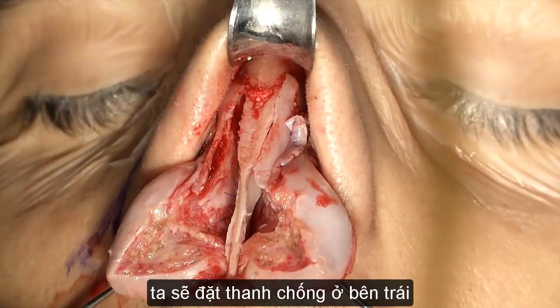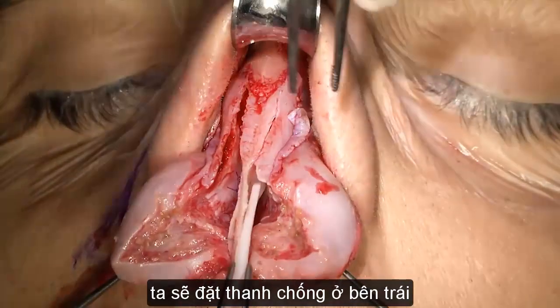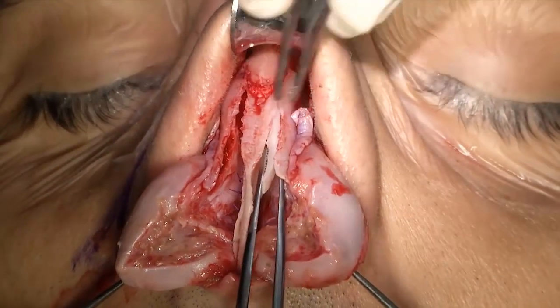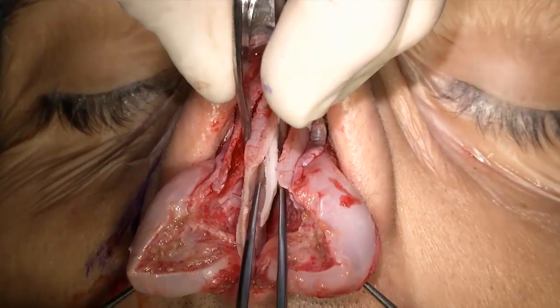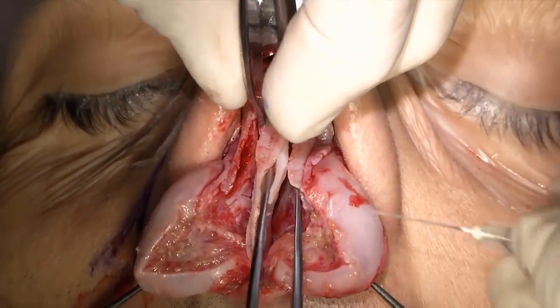Let me put a spreader on the left, which just comes below the septal T.